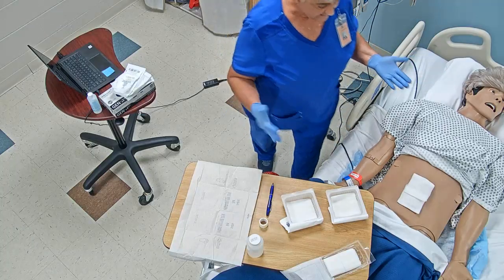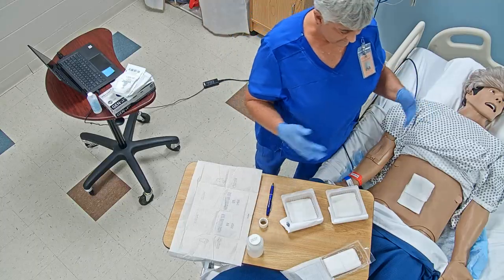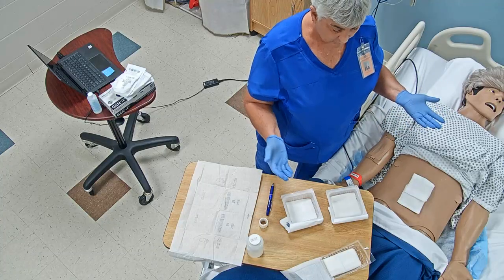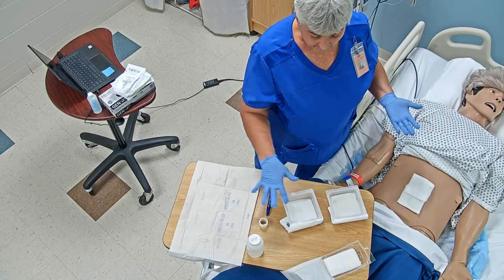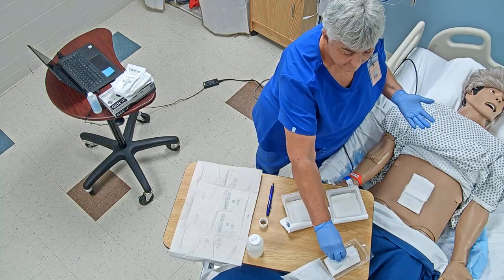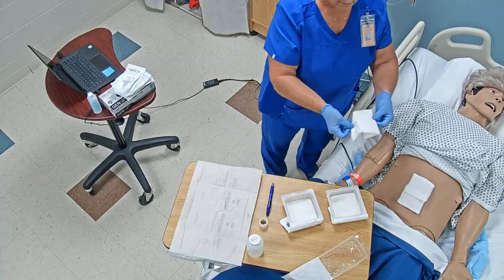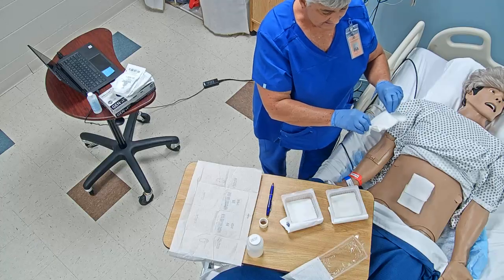Once I've done that, and of course I'm putting the dressing on that the physician ordered. This is what came off of it, so I'm redoing what. But we would go with whatever the doctor orders. Doctors have different dressings they like. I'm done with this, so now I can cross over it. So I'm going to go ahead and pick this up. Just touching, so you see the blue line. The blue line is the outer portion of the ABD.